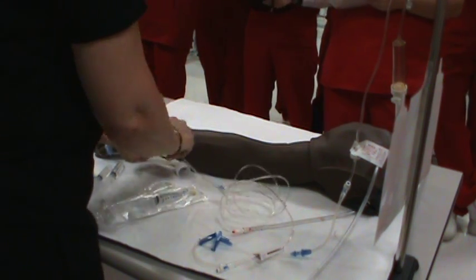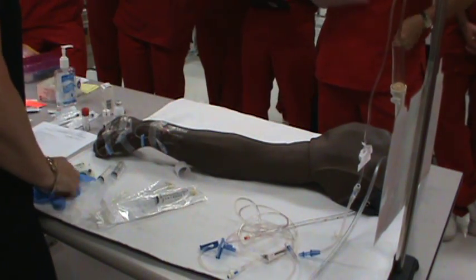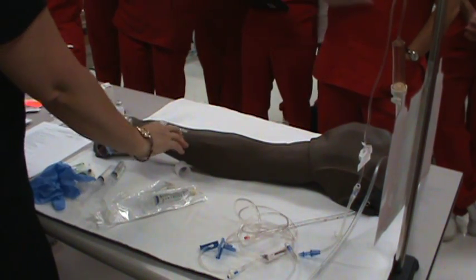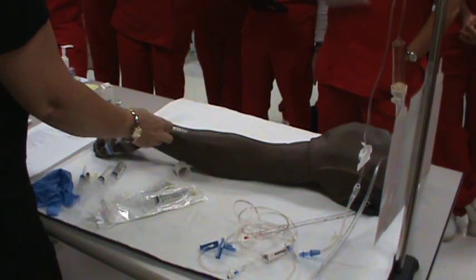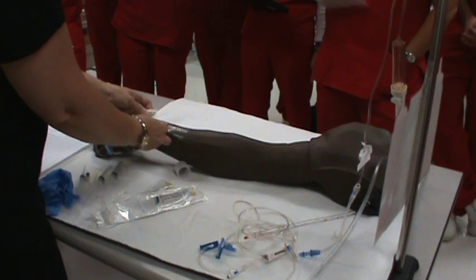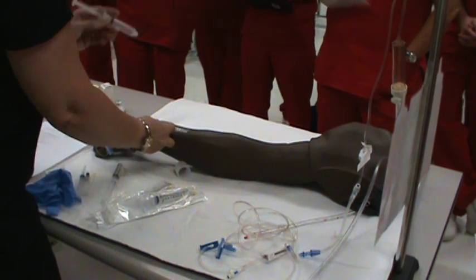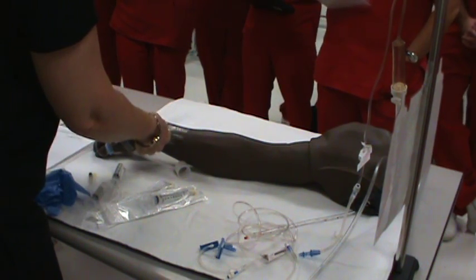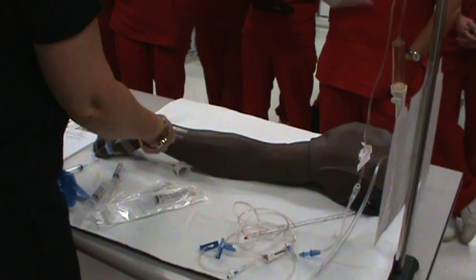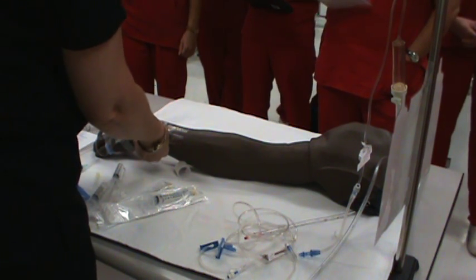So now we have a saline lock. So we just come in. Any saline lock, and it looks good. So clean your port, of course. Then you have your 3 mL and attach that.